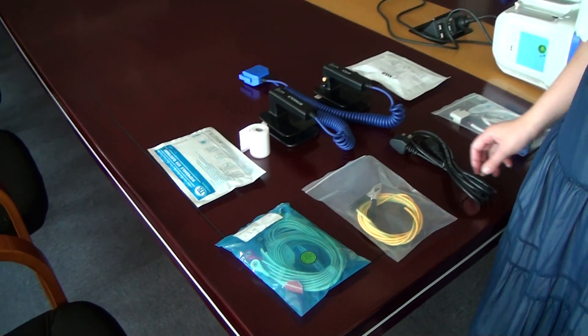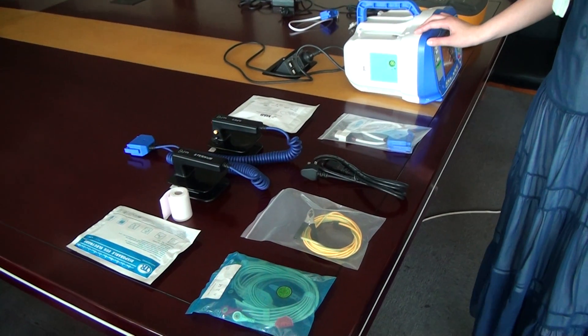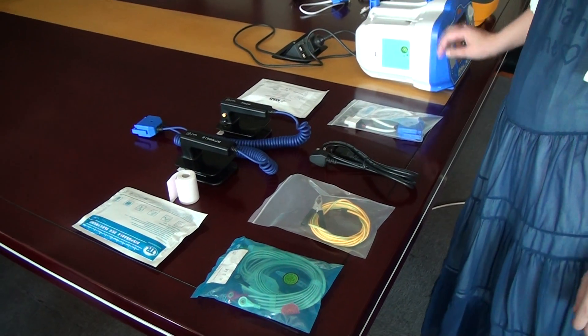Now we'd like to make an introduction for our defibrillator monitor. Firstly, we make an introduction for the spare parts.